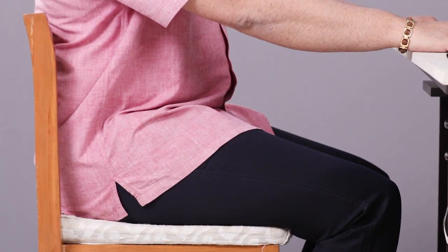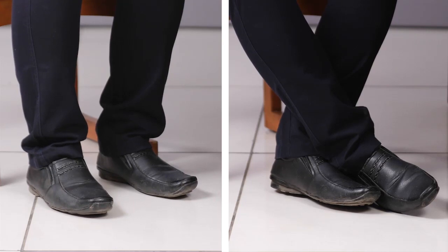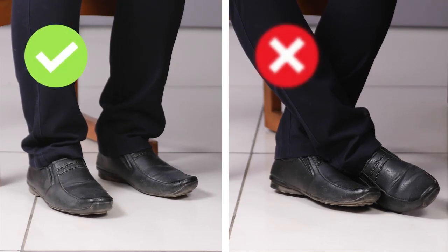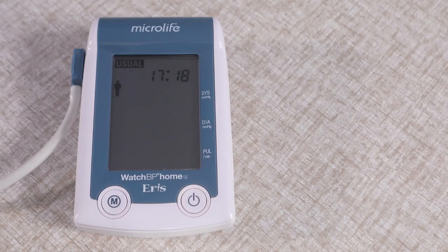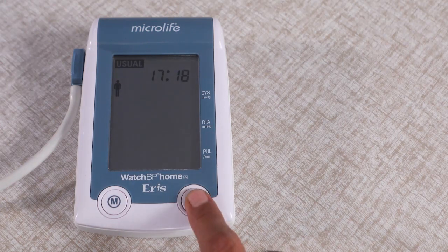Sit upright with back supported. Make sure your legs are grounded and not crossed. Do not speak and move while the machine measures your blood pressure. Once in position, press this button.